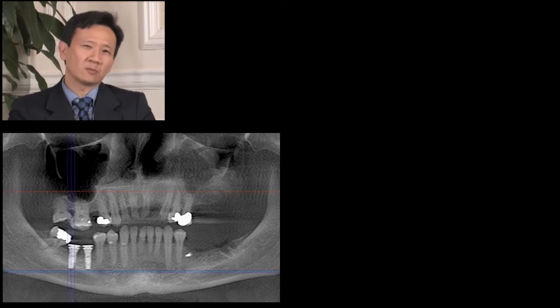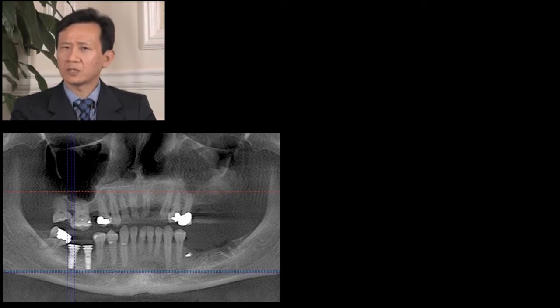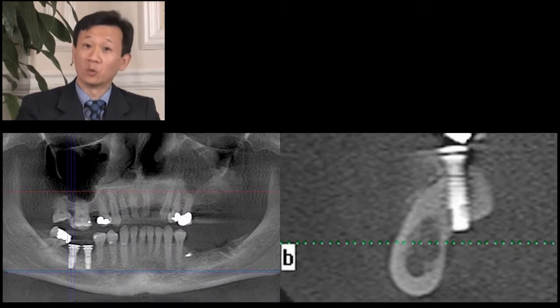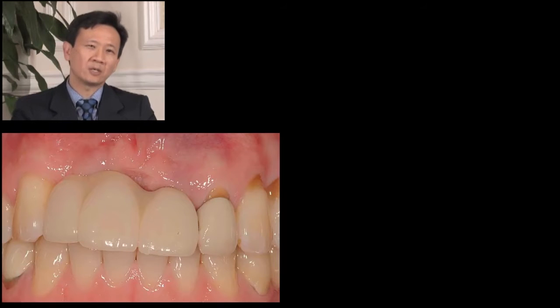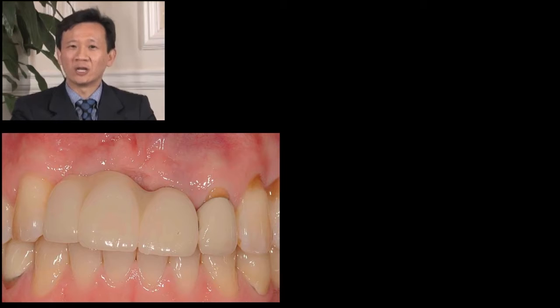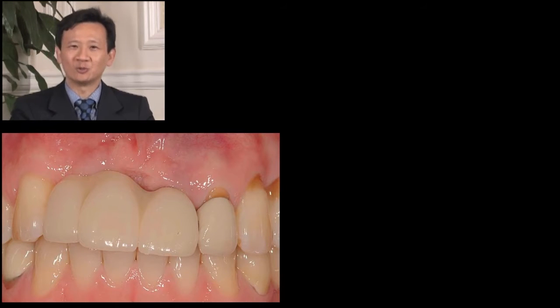Or a patient presenting with pain comes in, implants replaced. What are some of the issues? Is that implant really where we think it's going to be? Is it where we thought we placed it? Or maybe it's your best friend that comes in, had implants placed at a younger age, and said, I want to change my crowns, get a new smile.